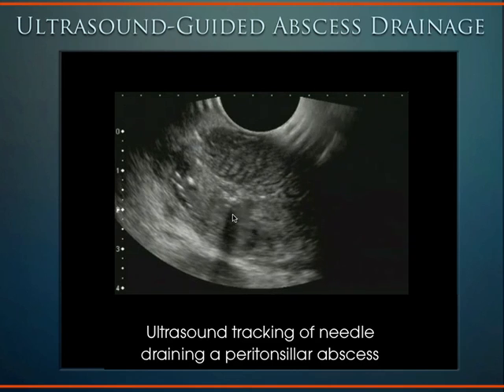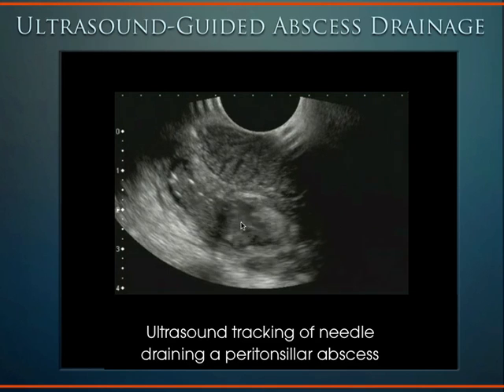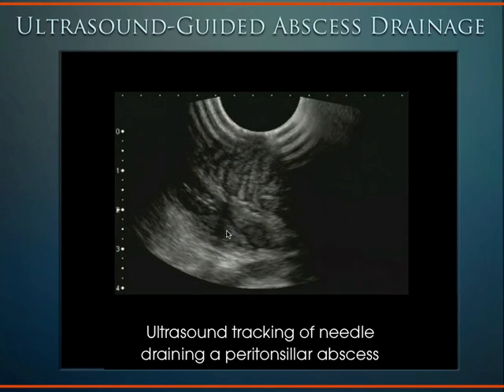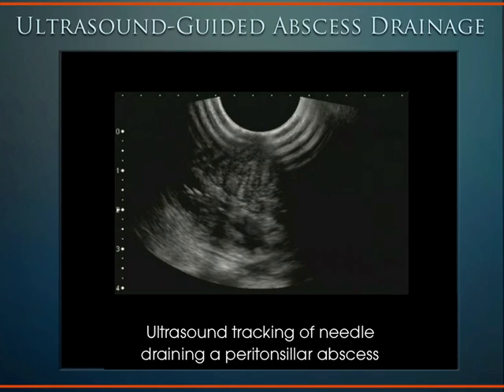We did inject a little bit of lidocaine. That's what you see being injected into the abscess, to help numb it up a little bit, and then we start to drain this out using ultrasound guidance until all the pus is gone.